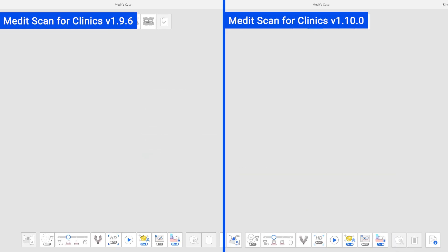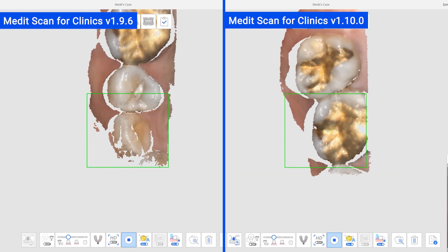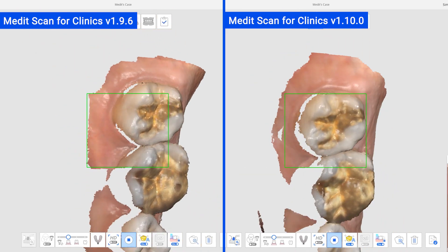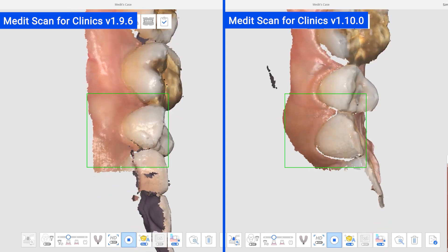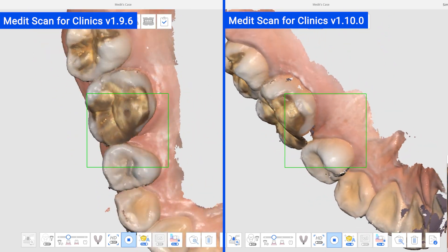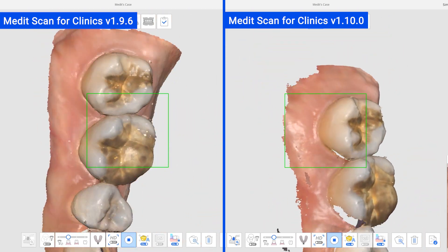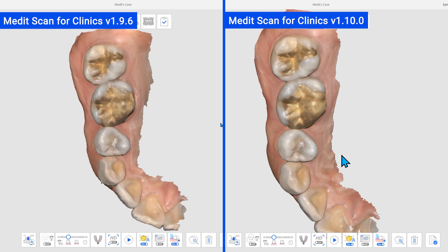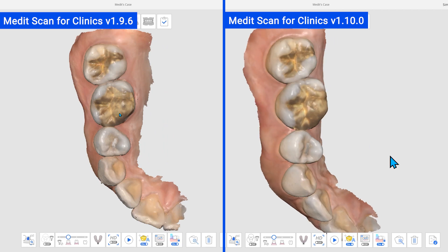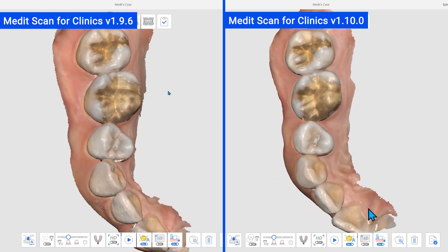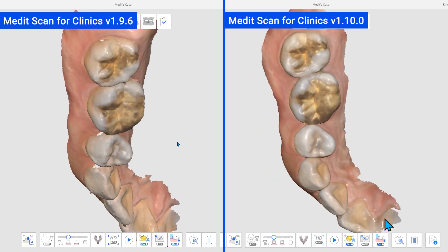Now, let's talk about major improvements to this version. First of all, we improved the 3D data display in MeditScan for Clinics to show data before and after processing more similarly.